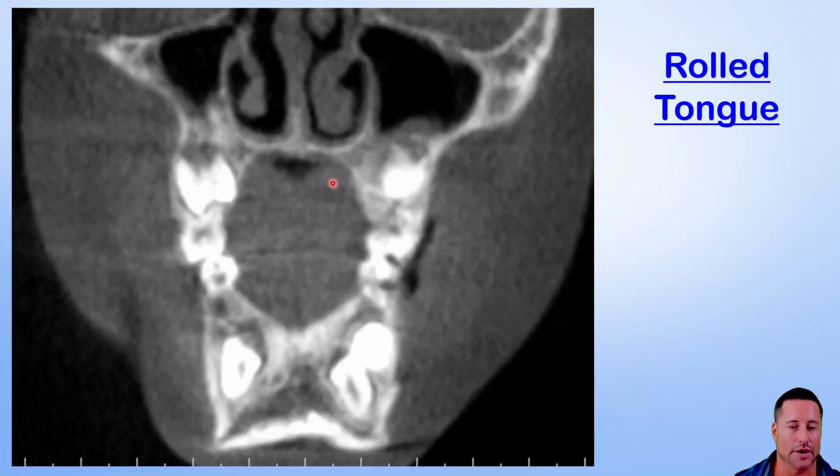This patient's narrow. Again, you can see that sort of invagination of the dorsum of the tongue. You can see that high vaulted palate. Got a little bit of hypoplasia of the right maxillary sinus, a little inflammation, could be just nasal cycling here, but this is where you start to put it all together and be able to paint a picture of what this patient is going through.